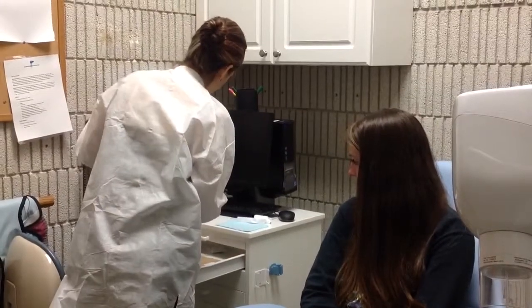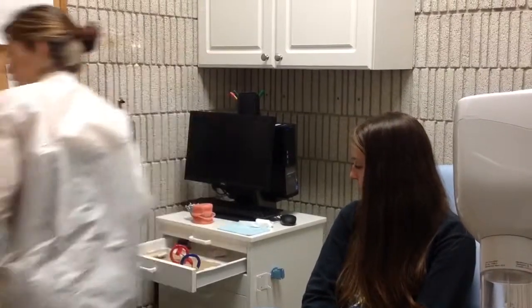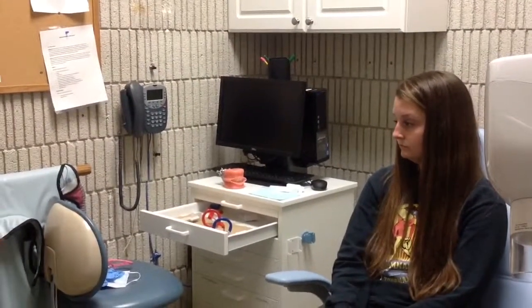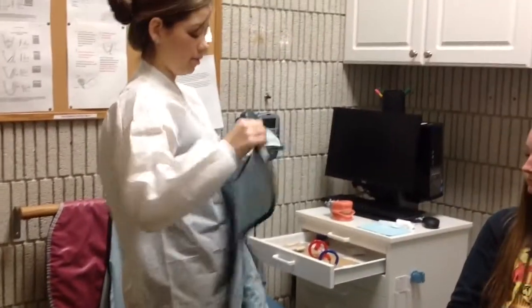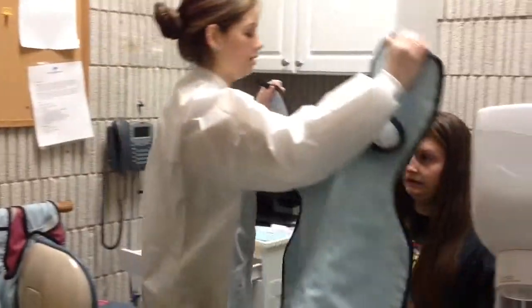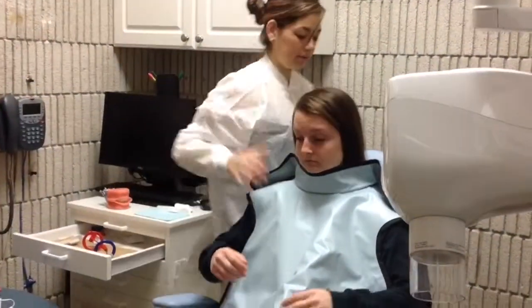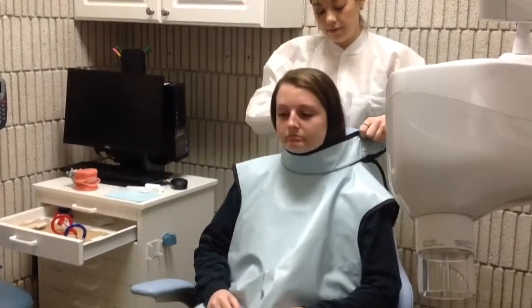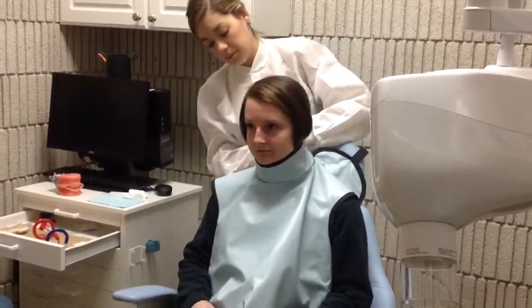So first, we're going to get you ready. I am going to have you wear this apron. This apron just protects you. This just makes sure that we only get pictures of your teeth because we don't want pictures of any other bones in there. All right. And I am just going to need you to lift your chin up. We're going to make sure it's nice and tight around your neck. Perfect.